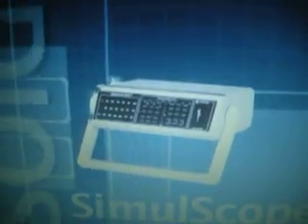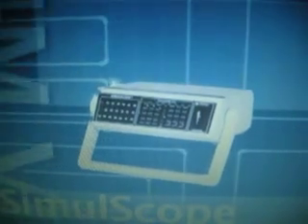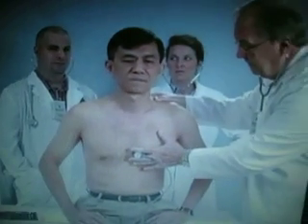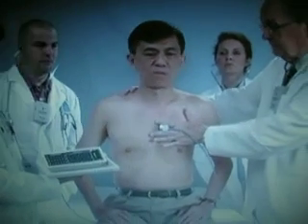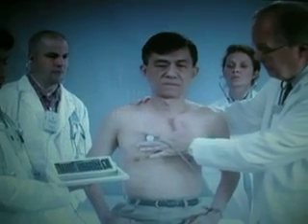The Simulscope is a wireless transmitter that broadcasts the patient's sounds to students and instructors wearing the wireless heart-band infrared headphone. A series of 8 discrete filters allow the sounds or murmurs to be accentuated or attenuated. A second model allows the R wave of the ECG to be displayed as a flashing light. This will assist the student in determining the onset of systole.